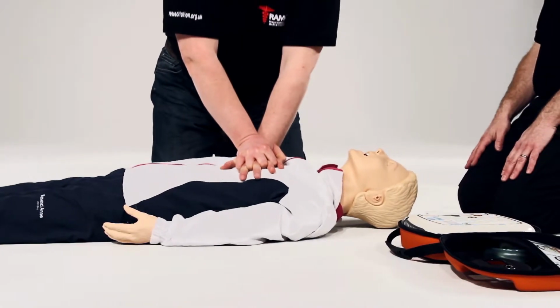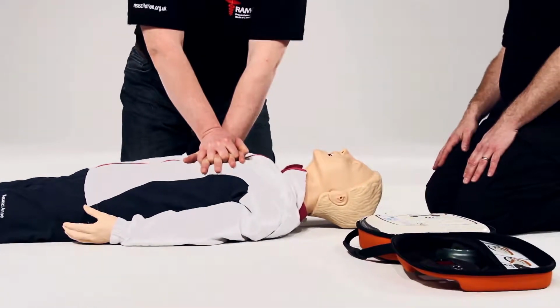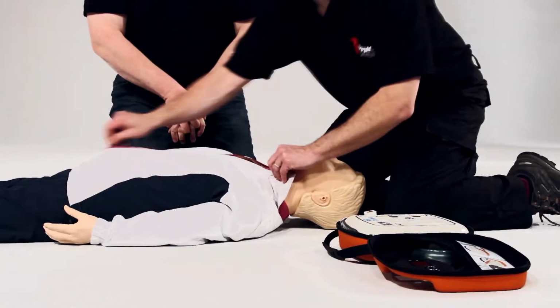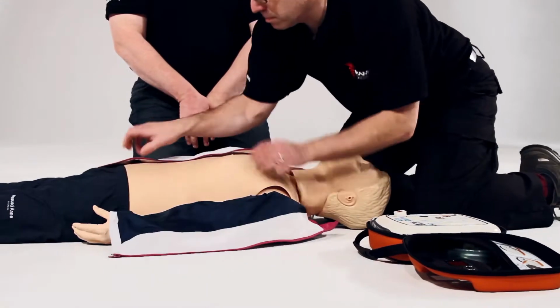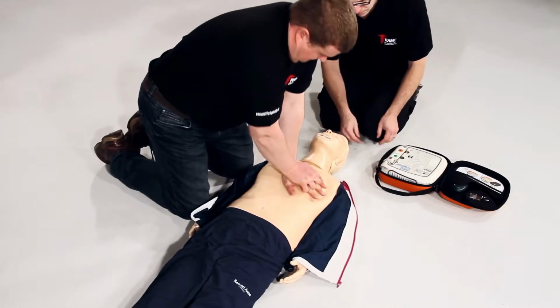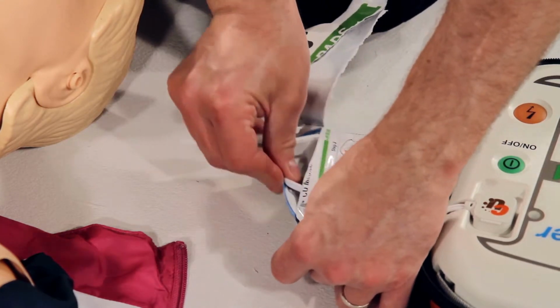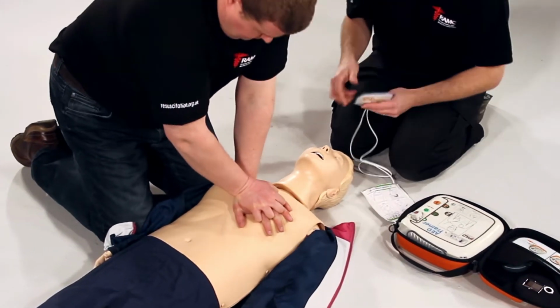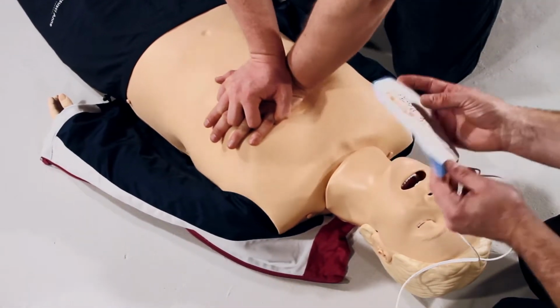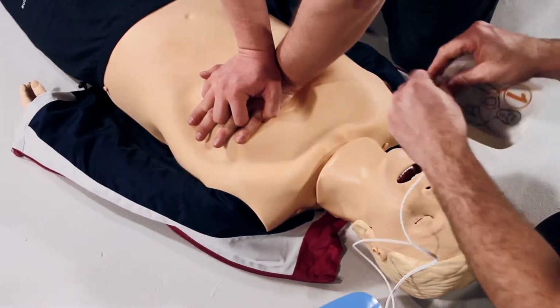Adult mode. Follow the voice prompt calmly. Remove all clothing from chest and stomach. Rip clothing if necessary. Tear open the pad's packaging. Look closely at the picture on each pad. Peel off the pad labelled 1 and stick to the bare skin of the patient, exactly as shown in the picture.